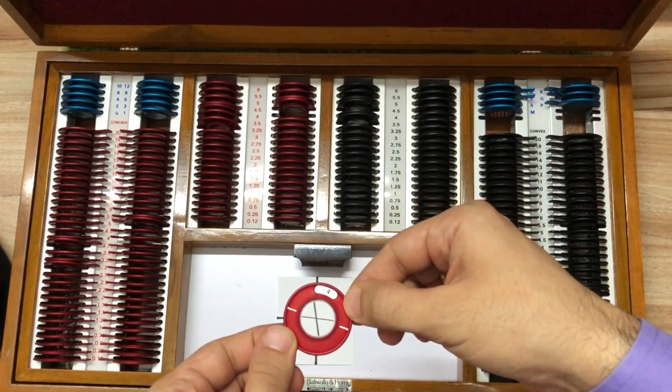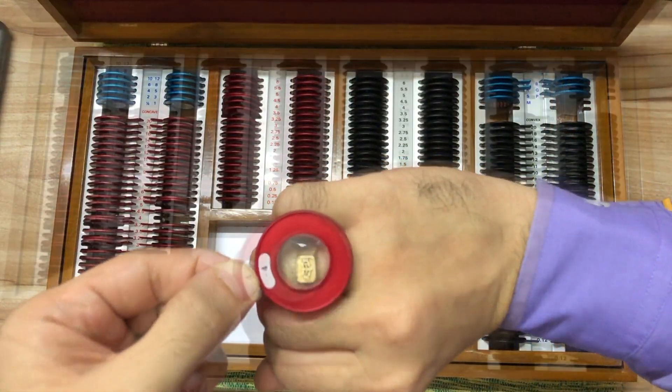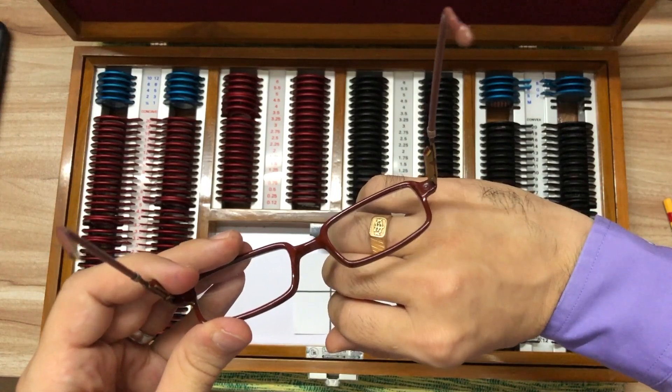There is also a crude way of knowing whether your lenses are made of glass or plastic material. You have to gently tap on the lenses using a metal object, usually a ring, and notice the sound it makes. Glass lenses make a high-pitched ringing sound, and plastic lenses have a more damp and low-pitched sound.